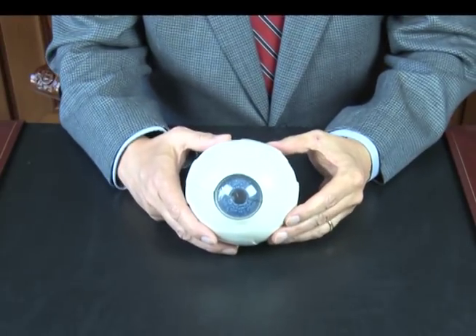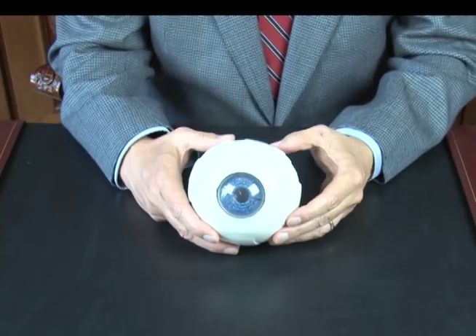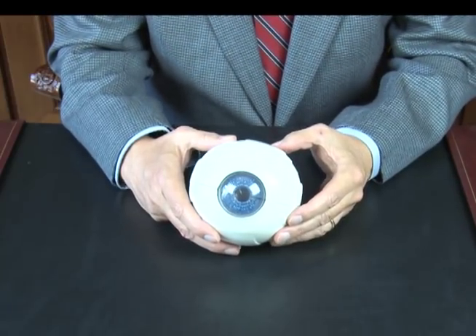I'm Dr. Scott Potler. Today, I'll discuss one method of scleral buckle surgery for the repair of retinal detachment. I'd like to use this eye model to review the anatomy of the eye.